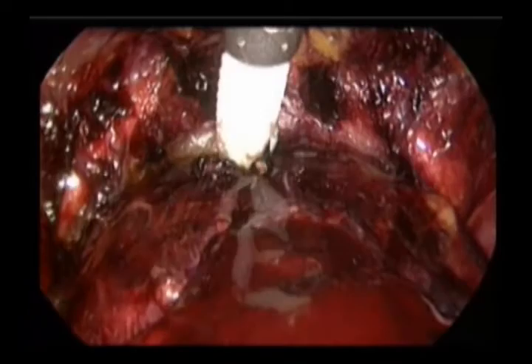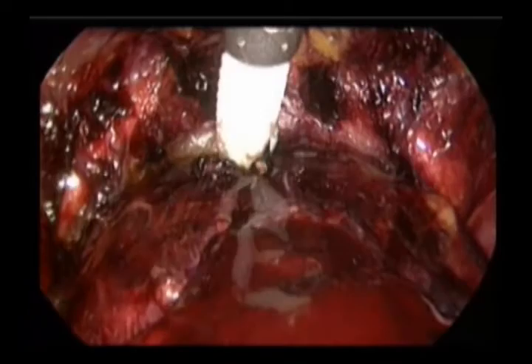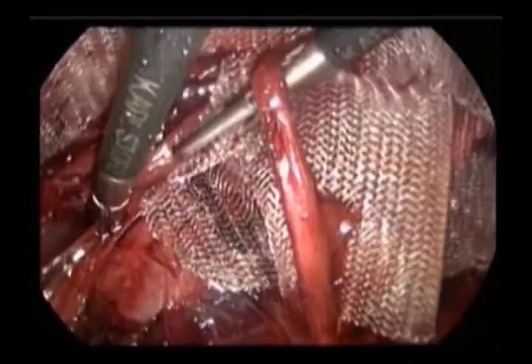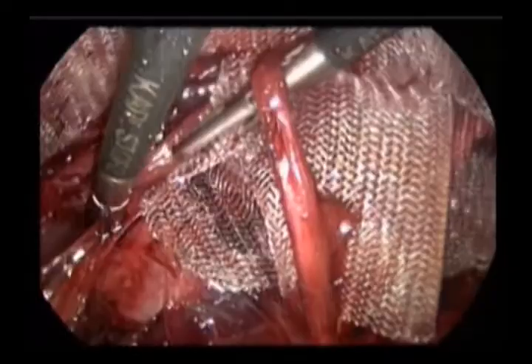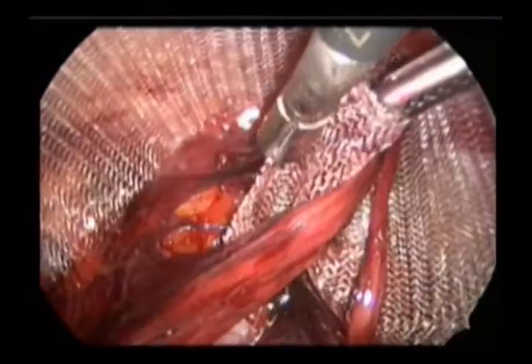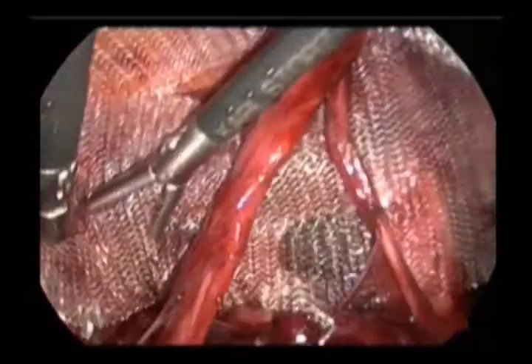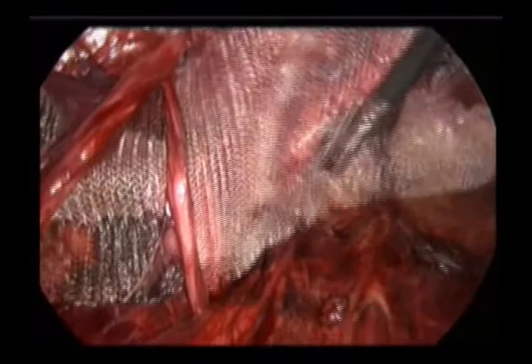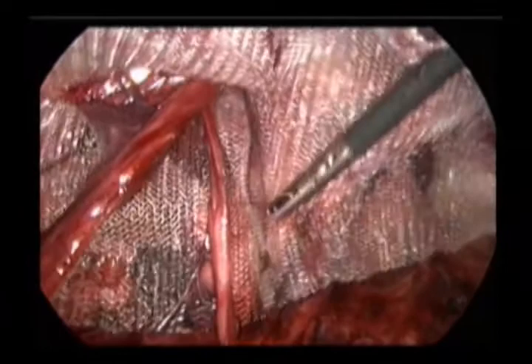You can see the mesh going down under vision — that's another innovation. The cord structures and vas deferens are coming in front of the split mesh, and the mesh is fixed. This splitting does not affect the strength of the mesh at all; at the same time, it prevents any migration of the mesh — the mesh gets locked there. I've been doing it for quite some time and we haven't had any problem at all.